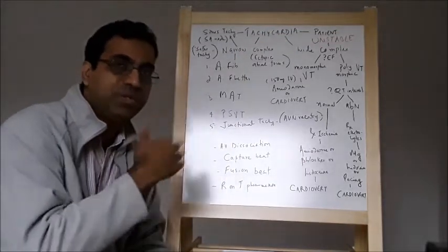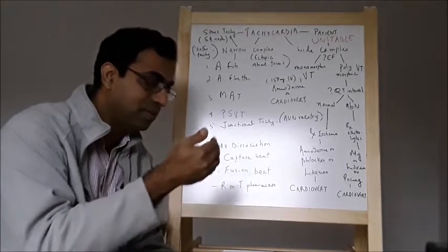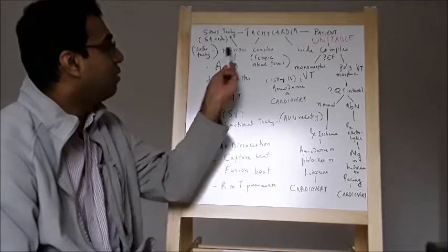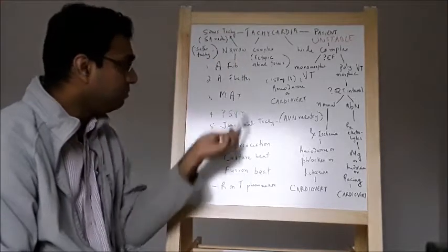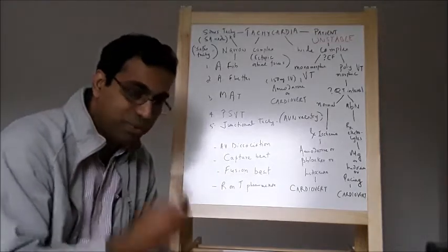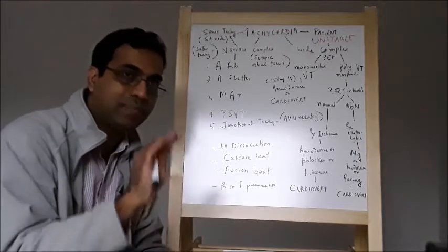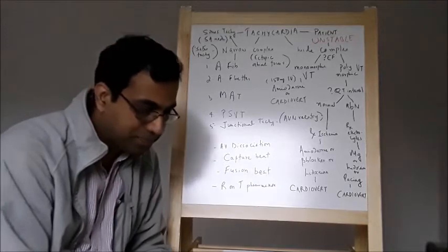These two videos are not connected in any way or form, but the first part of the tachycardia series, posted earlier, dealt with the narrow complex tachycardias. They were listed here, and we talked briefly about how you would make them out on your EKG strips. We did not go over the underlying pathophysiology, the history part of it, or the treatment of it.